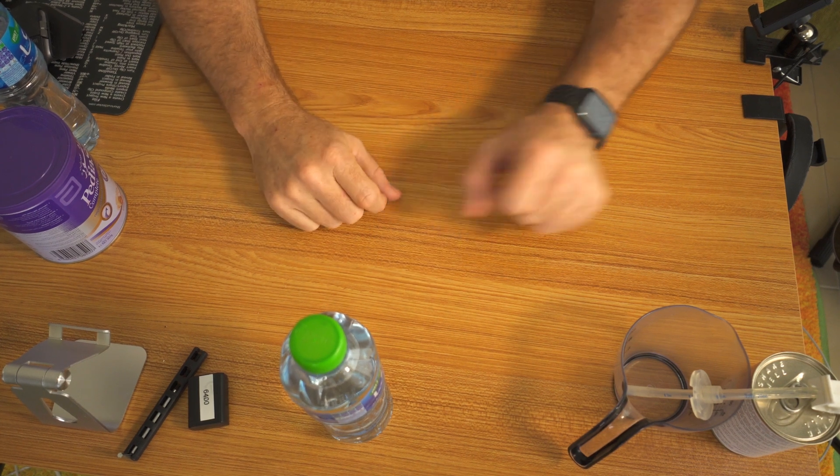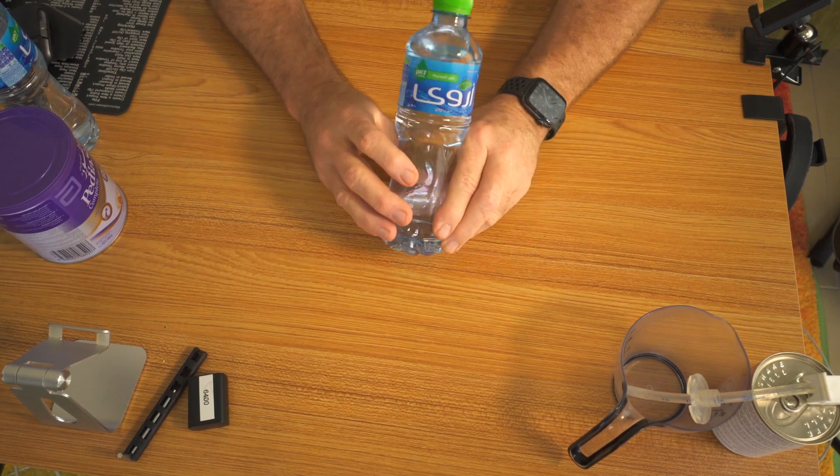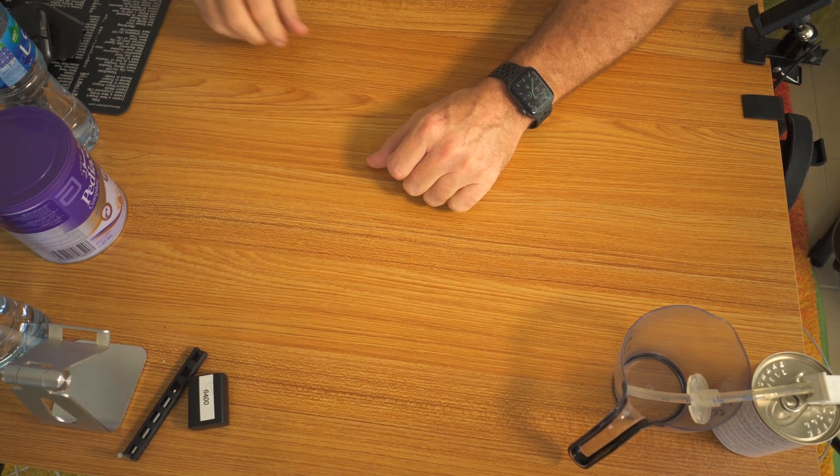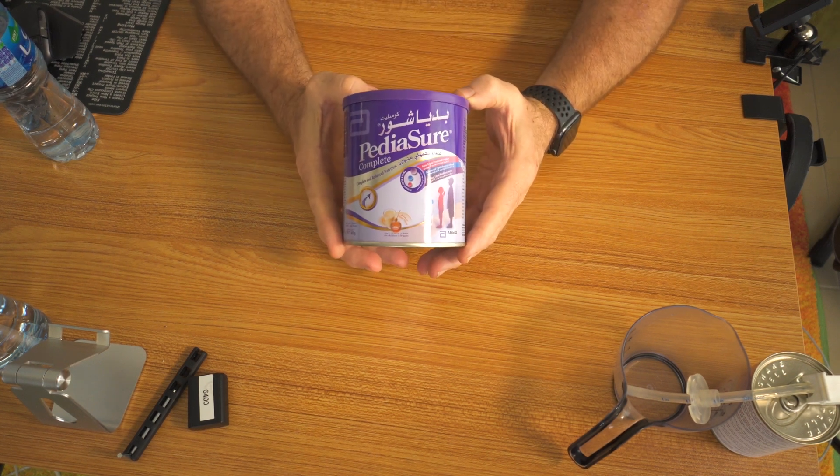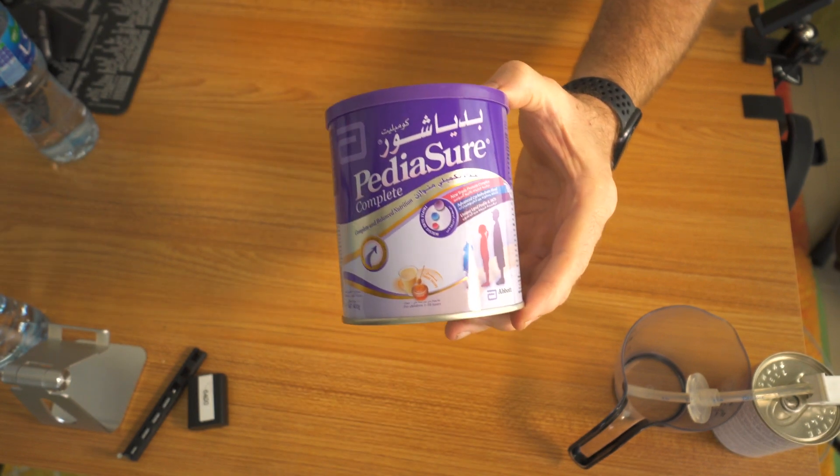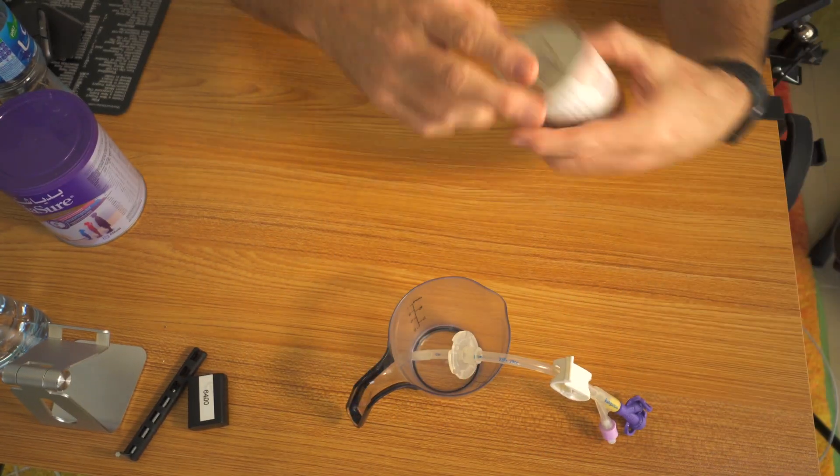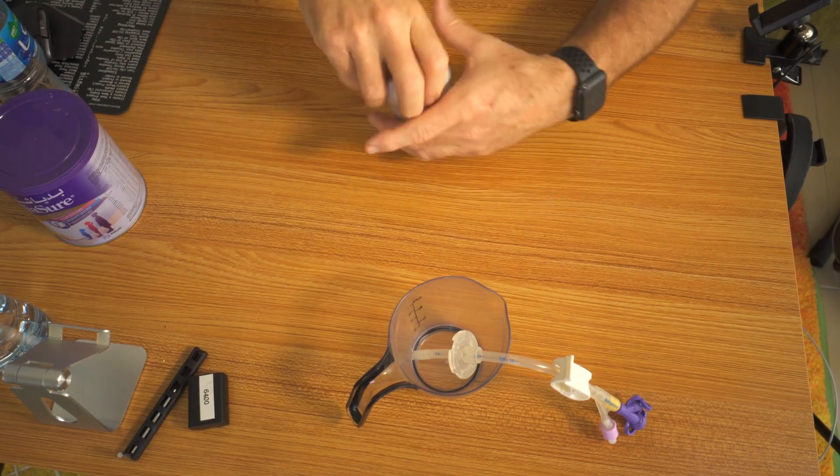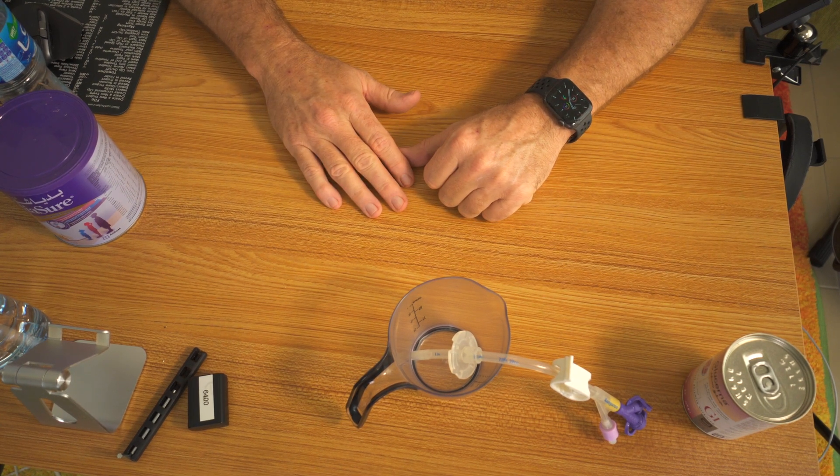Let's get ready to use the PEG tube. The first thing we have to have is some water, a bottle of clean fresh water, and whatever mix you're using. It can be a powder mix like this, such as PediaSure, which was recommended by the nutritionist. Another thing recommended was something called Glucerna in the can. It's a liquid pre-mix. I used both, mainly because I was bored of using the same thing over and over.